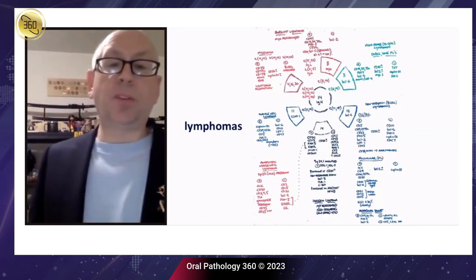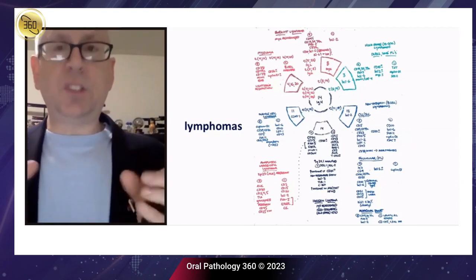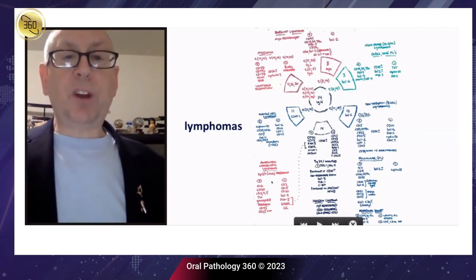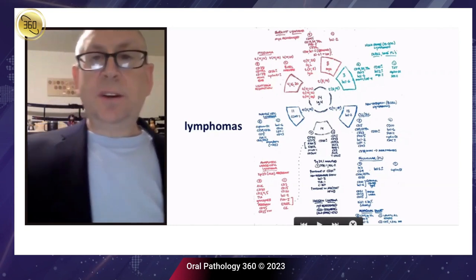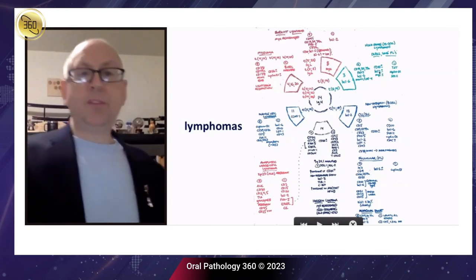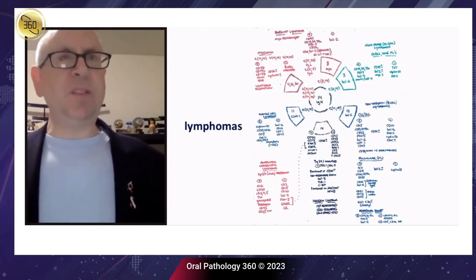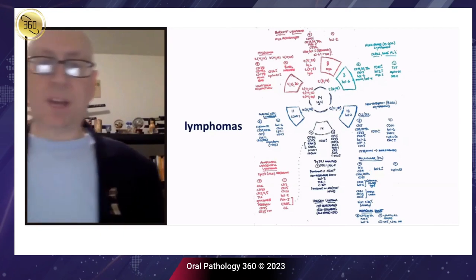And the other thing is you look at morphologically. I mean, CLL, SLL, they're almost uniformly small cells. Mantle cells are probably going to be fairly small cells, whereas anaplastic large cells, Hodgkin's, diffuse large B cell, they will have some larger nuclei. And then if they're in the plasmablastic or plasmacytoma-like, then you're in high-grade plasmablastic lymphomas, so HIV, immunosuppressed, Epstein-Barr-related, myeloma type stuff like that.